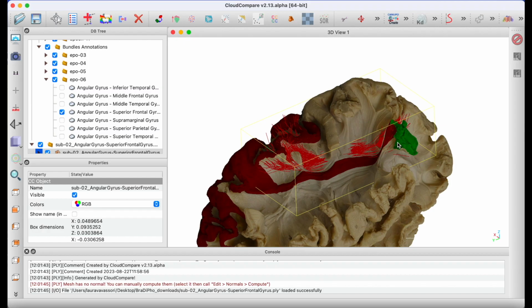Second, there is an important detail that I haven't revealed to you yet about this tractographic reconstruction of this connection. That is the fact that this representation comes from the concatenation of 39 subjects, and therefore I would expect my tractography to be more comprehensive of interindividual variability.